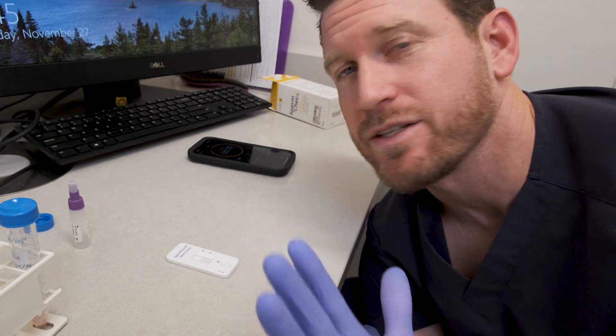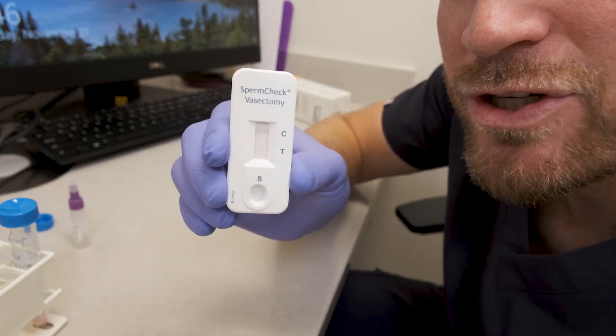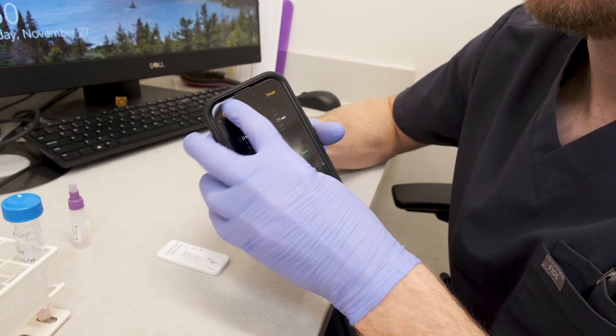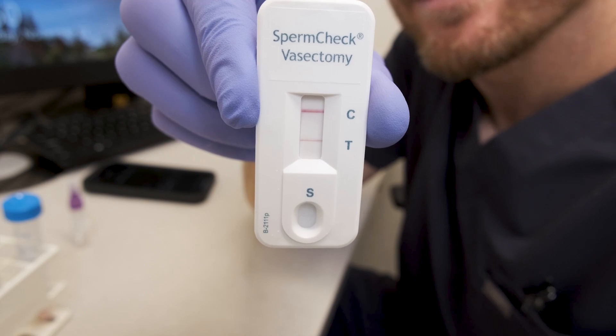While we wait, let's talk about how this test works. According to their website, it's measuring a specific protein found in sperm heads. It doesn't say exactly what protein, just that it's present in sperm and this test detects it. Just two minutes in, we're already starting to see lines show up. Seven minutes are up — two solid lines on the high concentration sample.